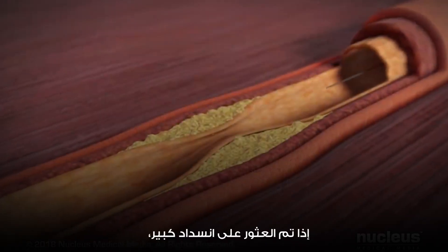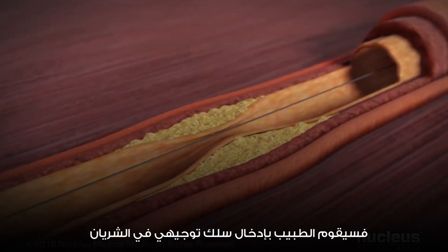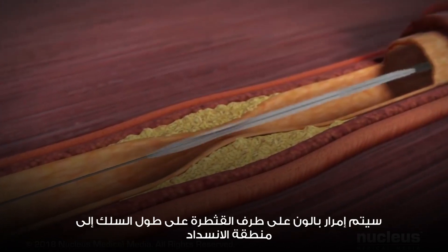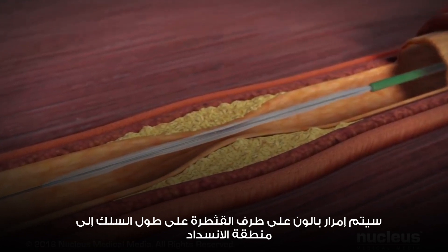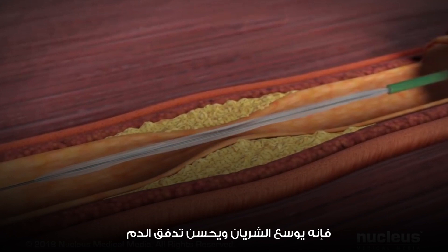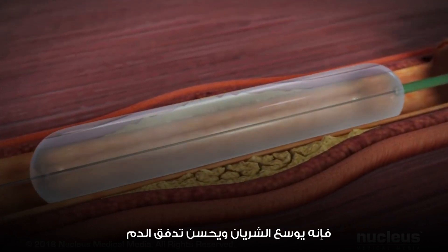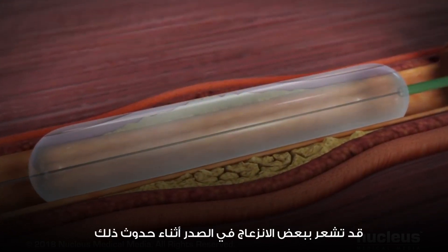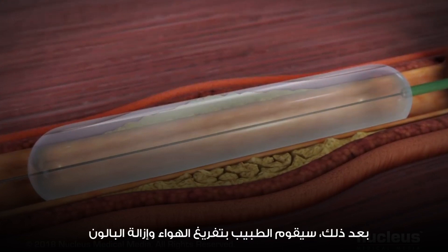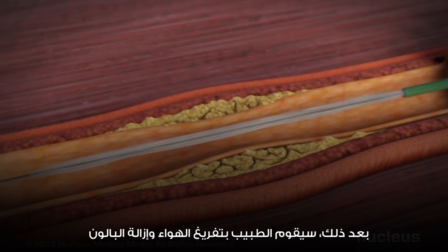If a significant blockage is found, your doctor will insert a guide wire into the artery. A balloon on the tip of the catheter will be moved along the wire to the blockage. When the balloon inflates, it will expand the artery and improve the blood flow. You may feel some chest discomfort while this is happening. After this, your doctor will deflate and remove the balloon.